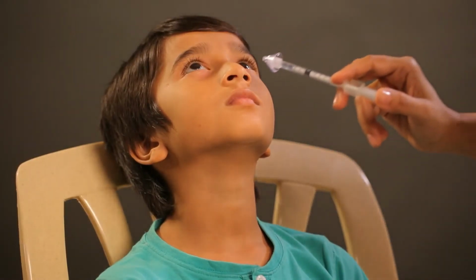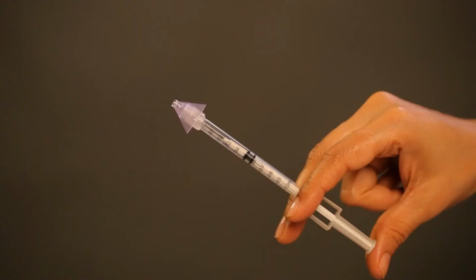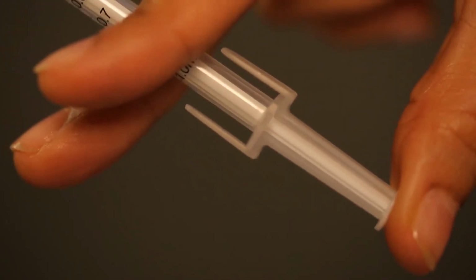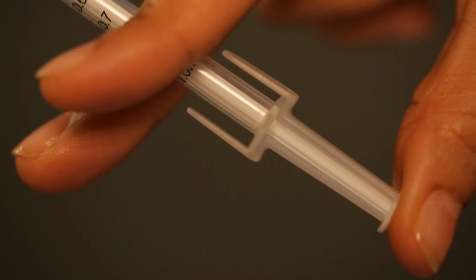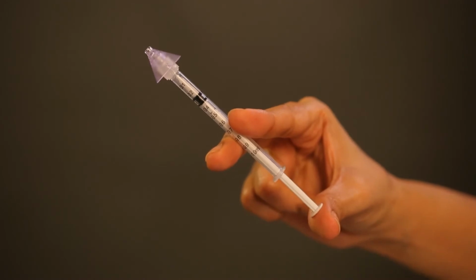Place the spray device at the base of the nostril of the recipient sitting upright, with the head slightly tilted back. Push the plunger firmly in a single stroke to deliver the vaccine. 0.25 ml, that is half of the dose, is delivered. The plunger will stop automatically because of the presence of the dose divider. Draw back the plunger slightly and remove the dose divider.